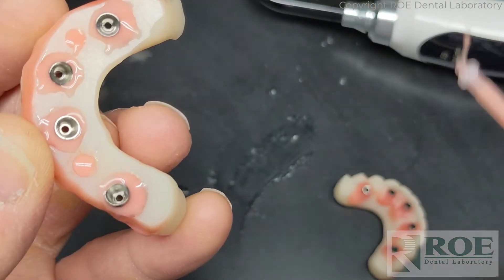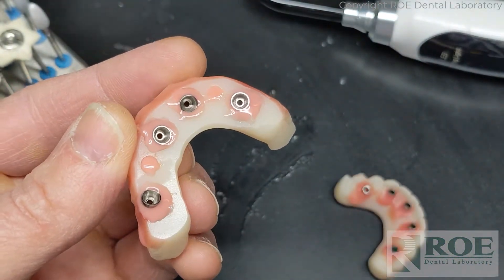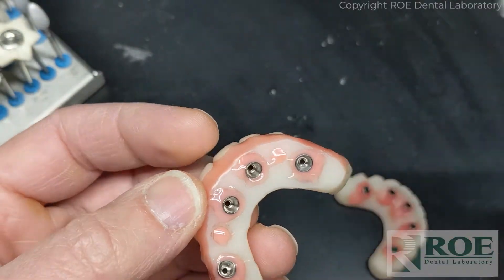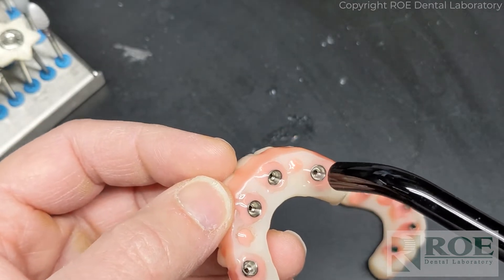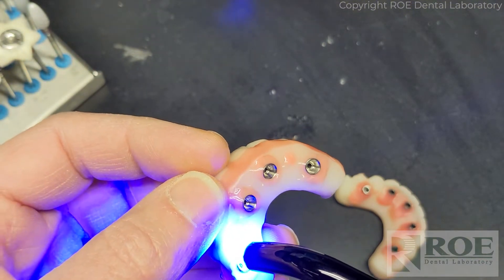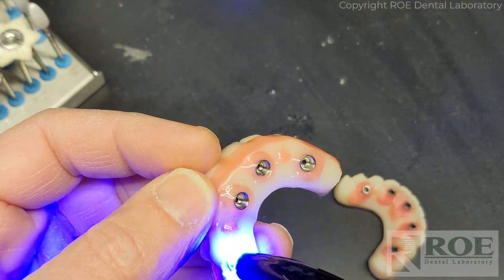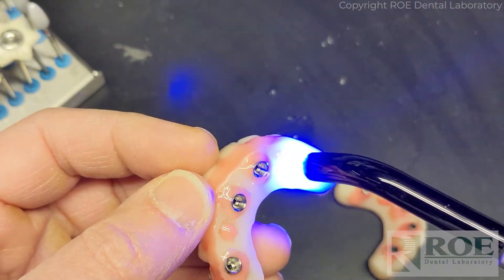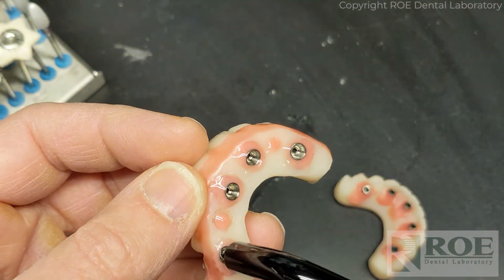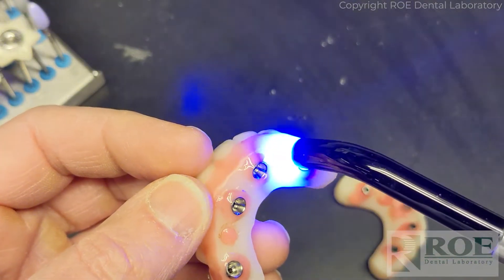Remember the patient is only going to wear this for maybe two weeks - they could just wear it for a few days if you sent the prosthetic in. If you send us the take-home prosthetic, we could scan it, mount it, articulate, and do everything we need to do. We could return it to you if you wish, so maybe these rapid appliances are only in the mouth for three or four days.